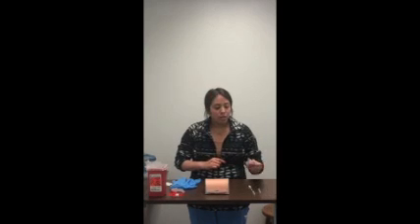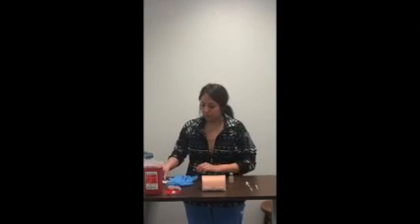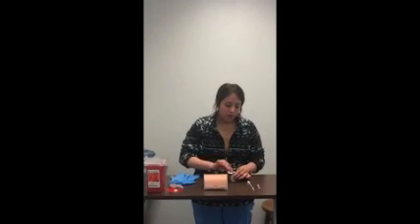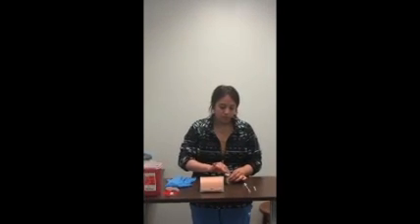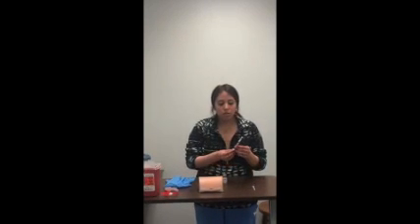After this, I check and make sure that my medication is not expired. I will then clean my vial — cleaning the outer part — and draw back 0.5ml of air to inject into the vial.